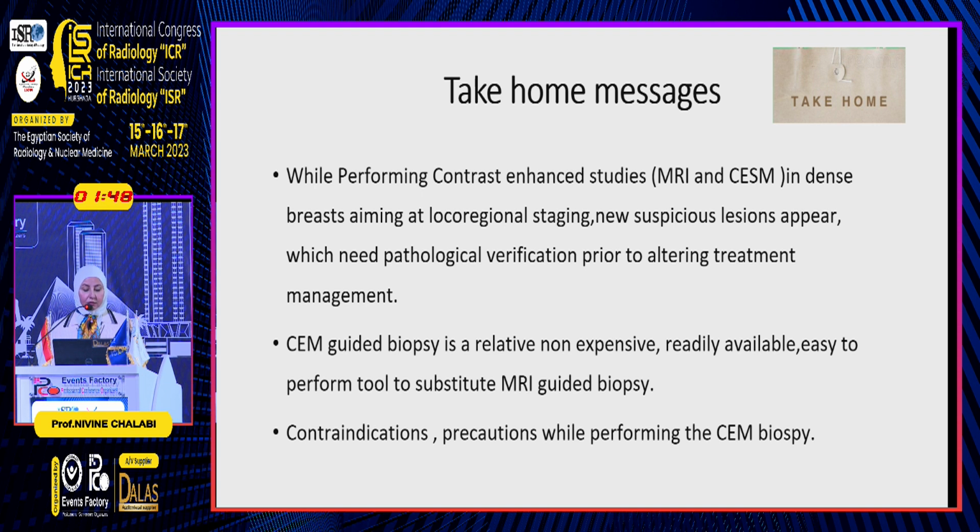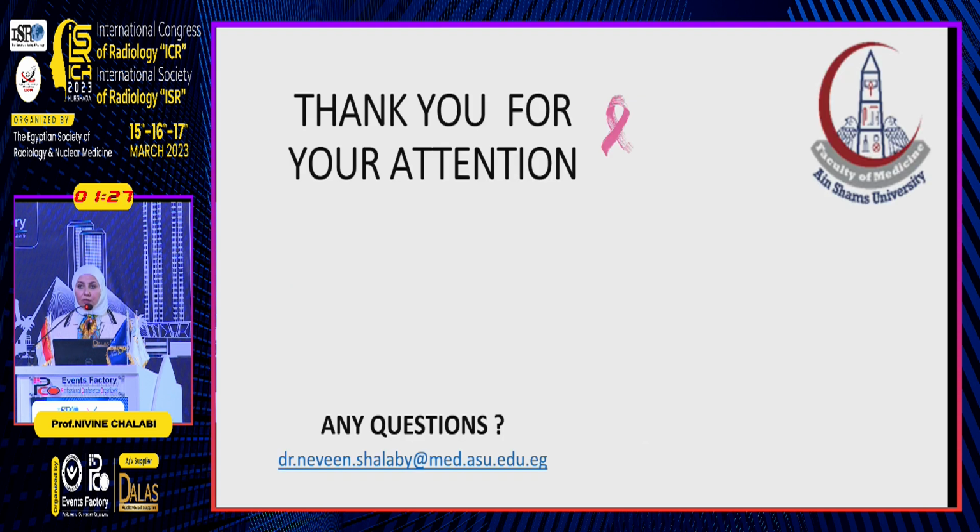So contrast-enhanced mammography guided biopsy is a relatively inexpensive, readily available, easy-to-perform tool to substitute MR guided biopsy. The contraindications and precautions while performing the biopsy have been detailed and should be taken into consideration. Thank you very much for your attention, and I'm open to any questions.